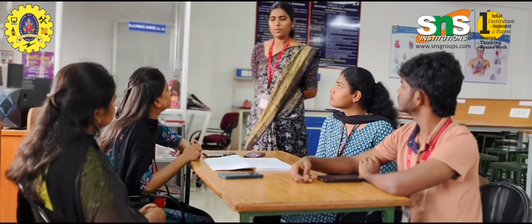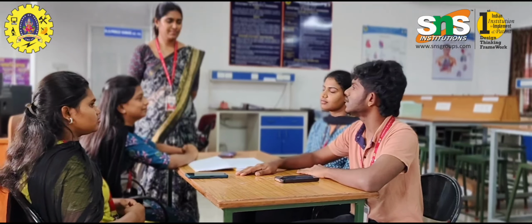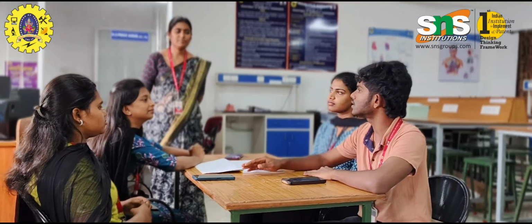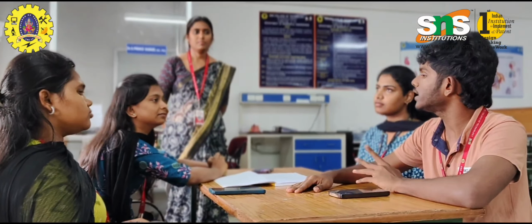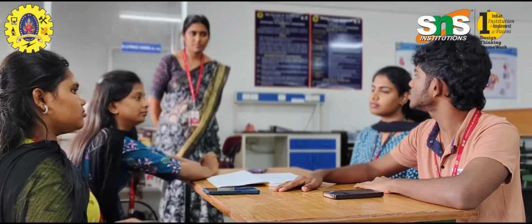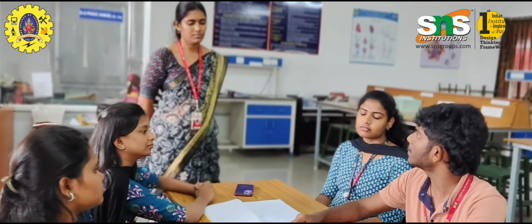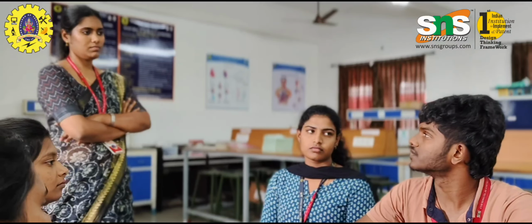Okay, can any other people give some suggestions on how we can ensure patient safety, especially with an ESU machine? Yeah, ma'am, I would like to answer that. First of all, for patient safety, we should ensure proper grounding, and also how the electrode should be placed, and also consider capacitive coupling. I would like to add one story. It is a real-time story that happened. A patient was undergoing gallbladder surgery, and capacitive coupling was happening. So current was leaking through some metal with the surgeon. The surgeon was not aware of that, so the patient had a severe injury because of that.